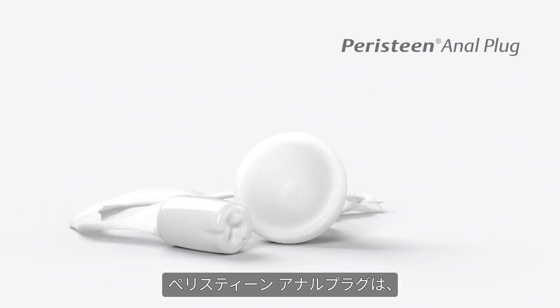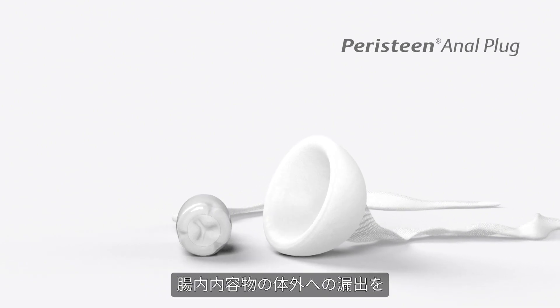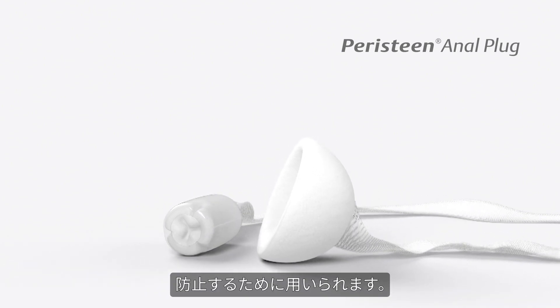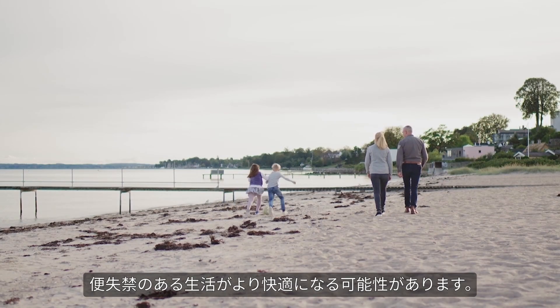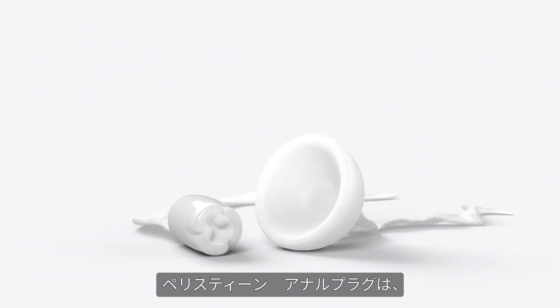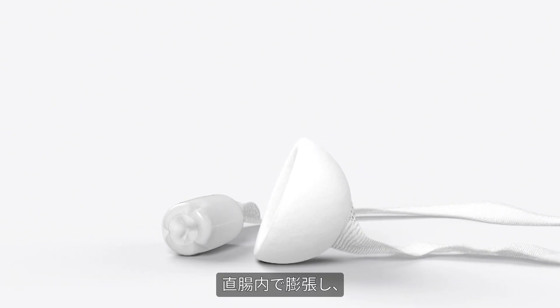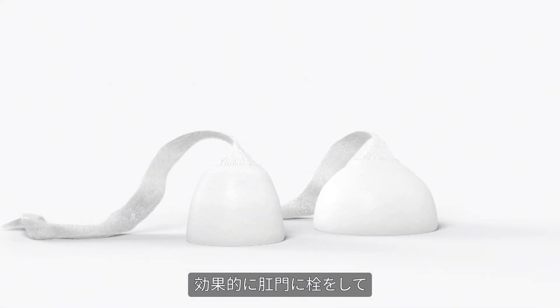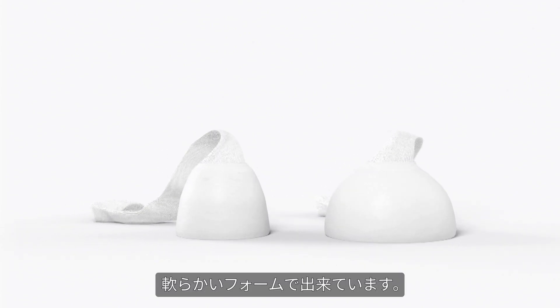Peristeen anal plug is a simple and discreet aid for faecal incontinence, intended to function as a barrier to the solid output in the rectum. It takes the worry out of socialising with others and makes it a little easier to live with faecal incontinence. It is designed with a soft foam that expands to the shape of the rectum and reduces the risk of skin irritation by creating an effective seal.